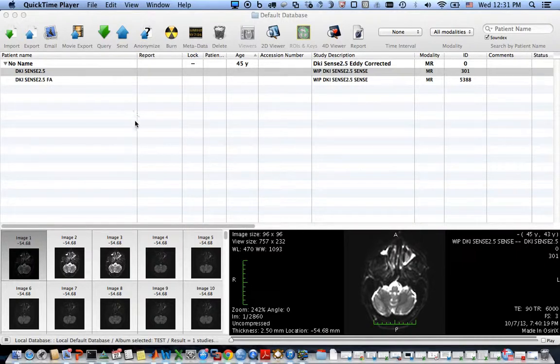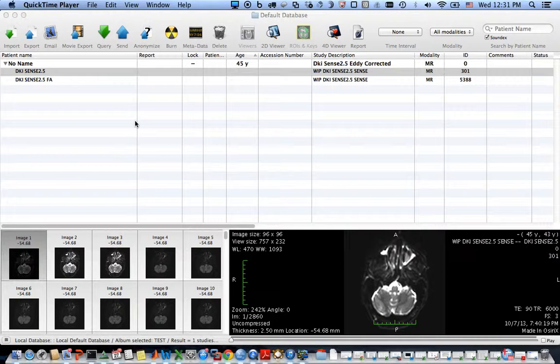In this particular case, I'm going to show you how to export the DTI dataset to Nifty format, then add eddy current correction using a tool from FSL, and then load the processed image back to Osiris database.